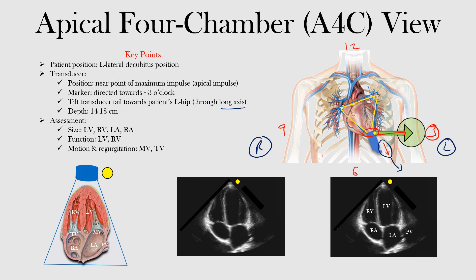So what are we seeing in this view? Why the apical four-chamber view? As the name implies, it gives us a view of the four chambers of the heart — the two atria and the two ventricles. Notice here we have a labeled image, an unlabeled image, and a cartoon depiction — three different ways you can look at it, so hopefully one of them sticks.